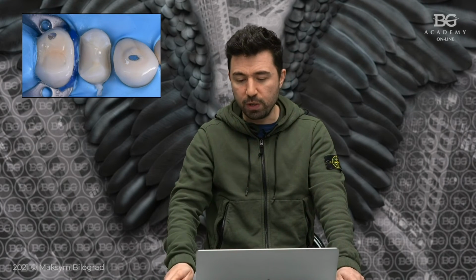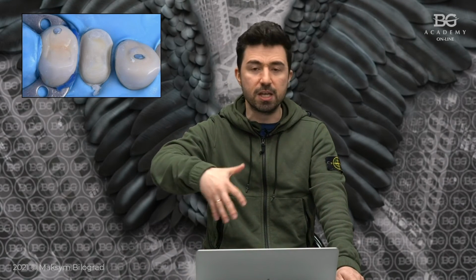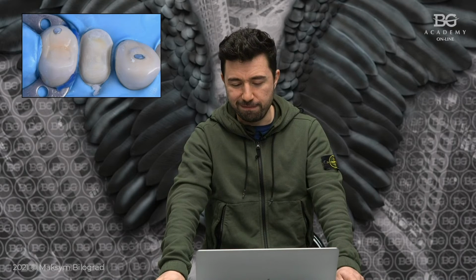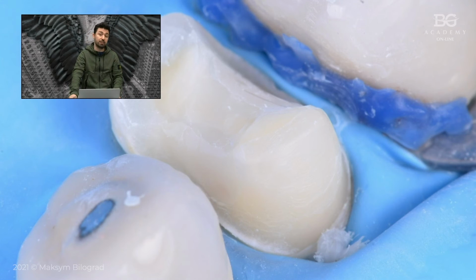Okay, so you see that we finished our build-up, then we made some final touches for the preparation, and we are ready to scan, or we are ready to take an impression for the restoration and to do a provisional restoration, because we have created a silicone index before.